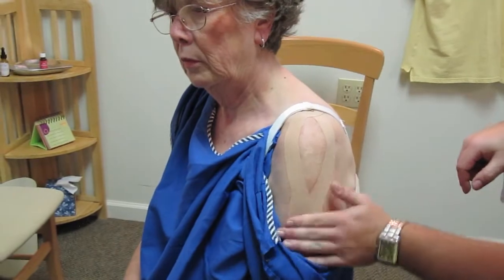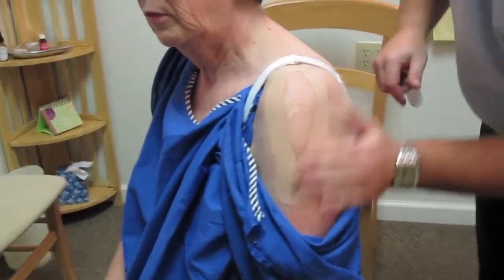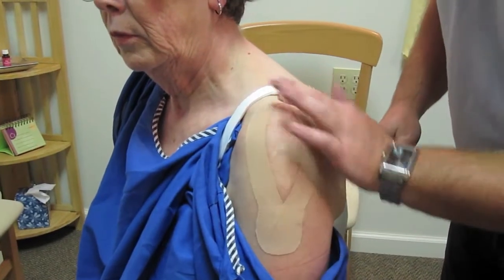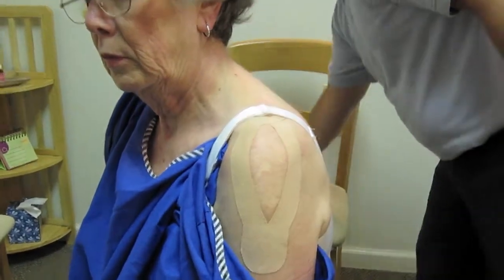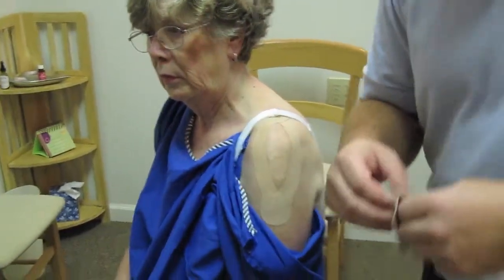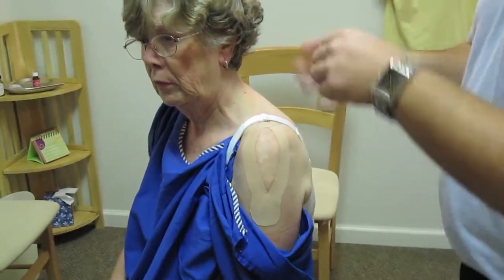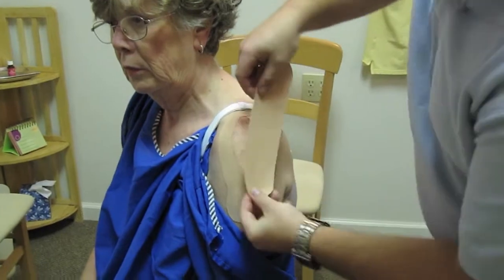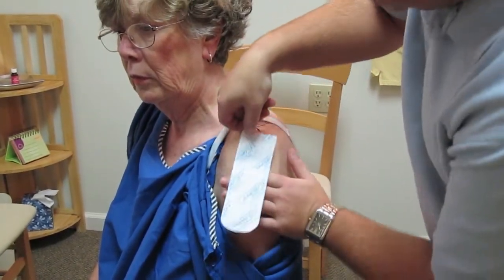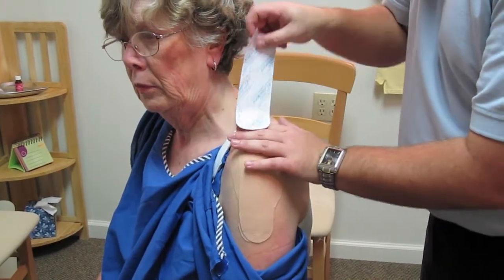The first one I put on is called the Y-Cut. The way to activate this technique is to rub the tape to activate the glue, which helps with performance better. Now for the second part of the taping, we put on the I-Cut, which goes right over the top of it like so. That helps support the shoulder again.